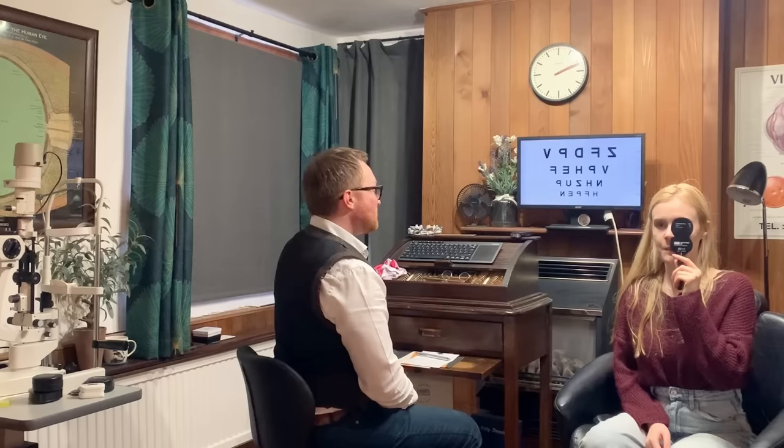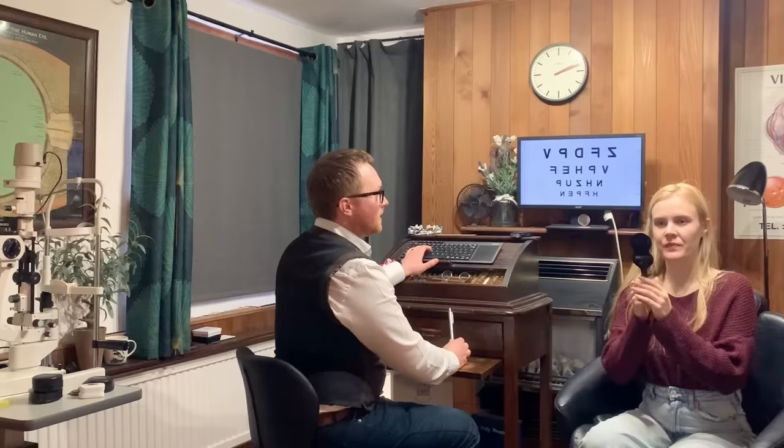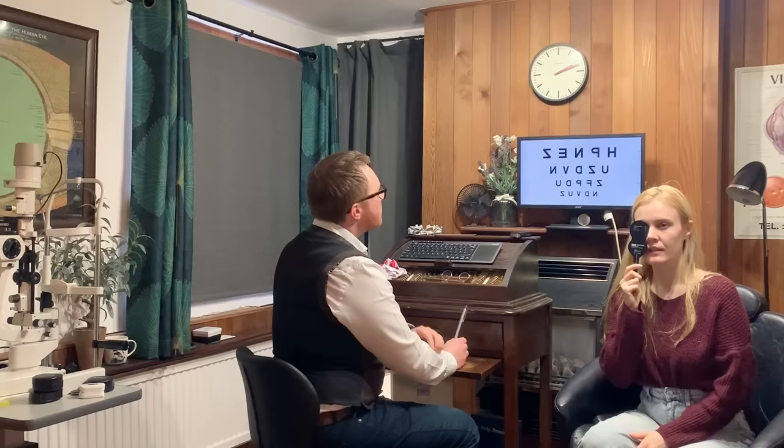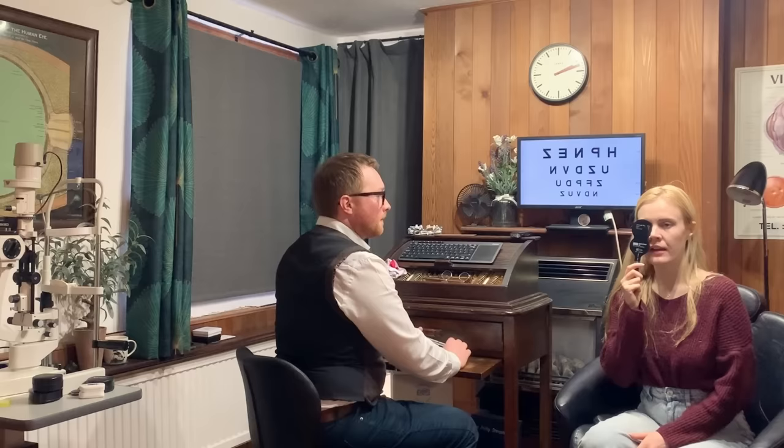It's fuzzy. I could try, but yep. I'm not sure I'd get it right. Don't worry. H? Yep. E-N. Very good, excellent. And if I get you to cover up your other eye, and we do the same again, and what would you say is the smallest one you can get comfortably there for me? Second from the bottom. Yep. Z, F, P, O.